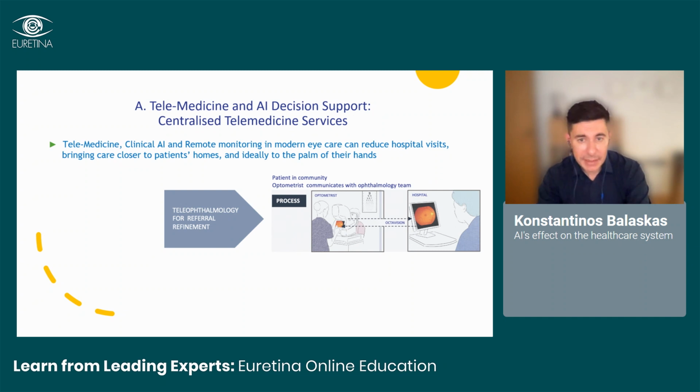So starting with telemedicine, the core principle of teleophthalmology is the ability to transfer imaging from, let's say, primary care to secondary care to an expert center for advice and guidance, or for digital referral triaging.